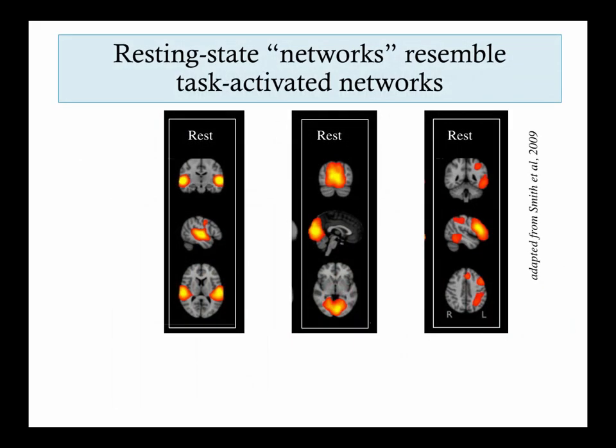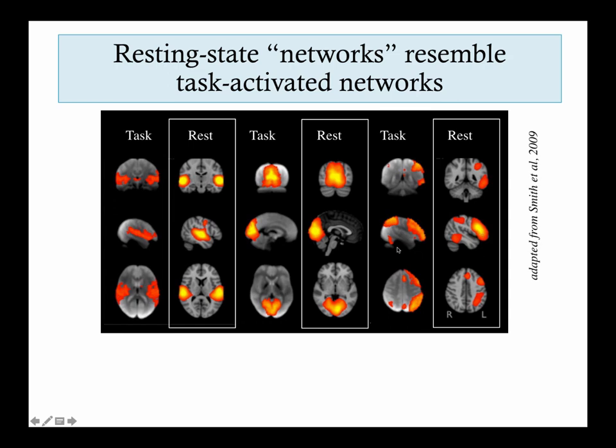And this was shown to generalize to a number of other brain networks. So if you look at the right and left auditory cortex, for example, these were highly correlated in resting state, and so were voxels within the visual cortex, and so were frontal and parietal regions that tend to be involved in functions like working memory. And this study did a direct comparison to task data and found that these patterns do align very well with systems that have been characterized with tasks.